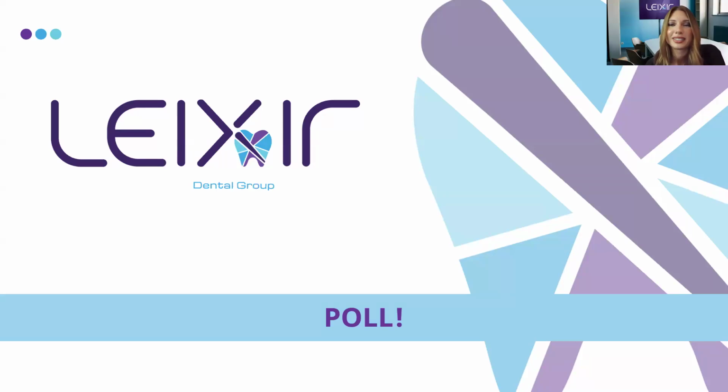All right. So kind of neck and neck there. We have 56% said true, 44% said false. So when reviewing your prep, make sure you look at the scan in color. So actually, which we'll talk about here shortly, you do want to look at that prep in monochrome because you'll be able to see your margin much better.